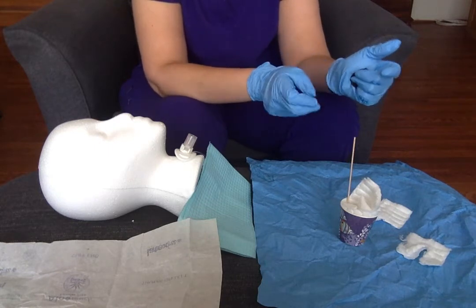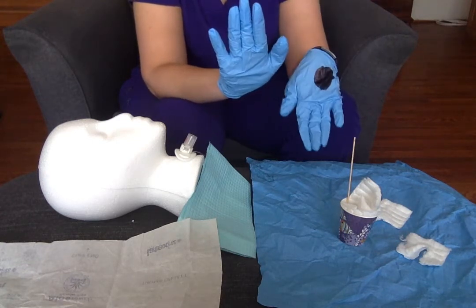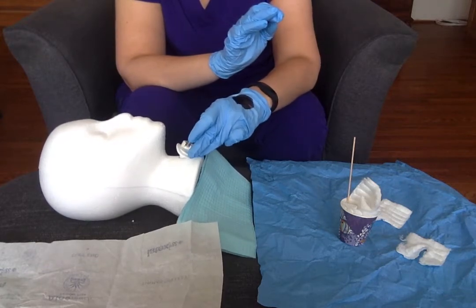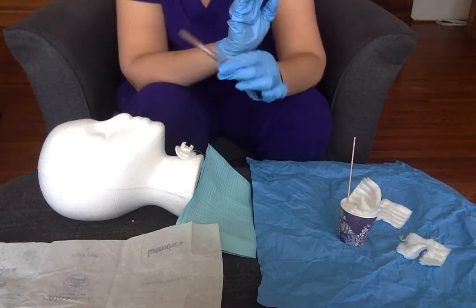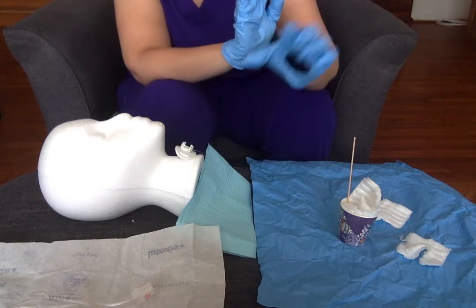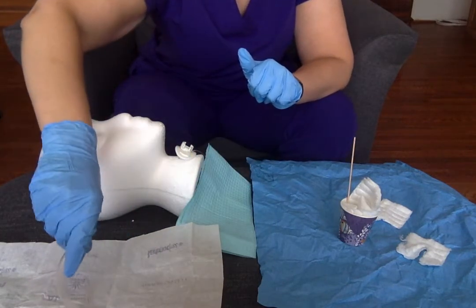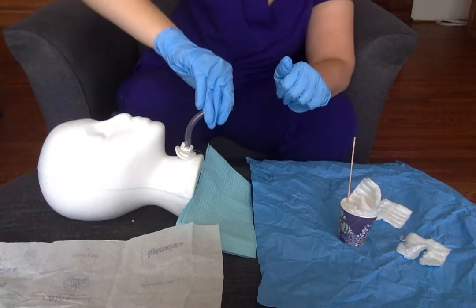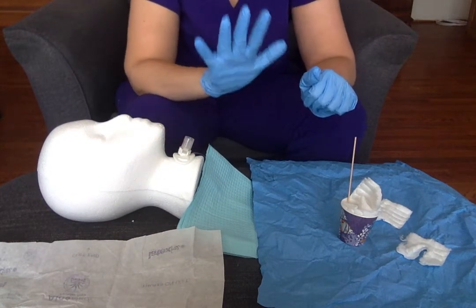The next thing I want to do is pull out this old tracheostomy tube and then start cleaning. This will stay sterile and this will be my quote-unquote dirty hand. I'm going to go ahead and pull out this inner cannula. Please don't mind my styrofoam mannequin here. This is dirty — this gets disposed of. I should have my next one open on a sterile package, so I pull the old one and dispose of it. Then I'm going to grab my new one with my sterile hand, touching only the little flanges on the side — the little pinch parts — and then I can go ahead and insert this very carefully. It's clipped on. I didn't touch my patient at all to do that.